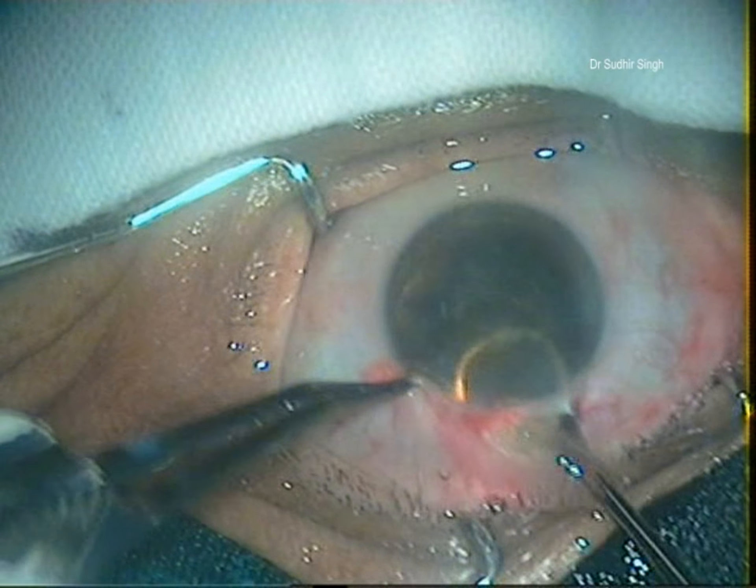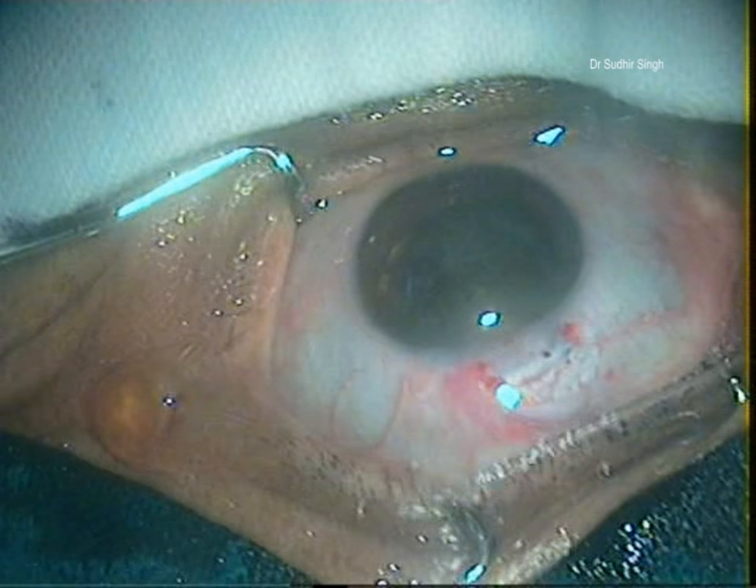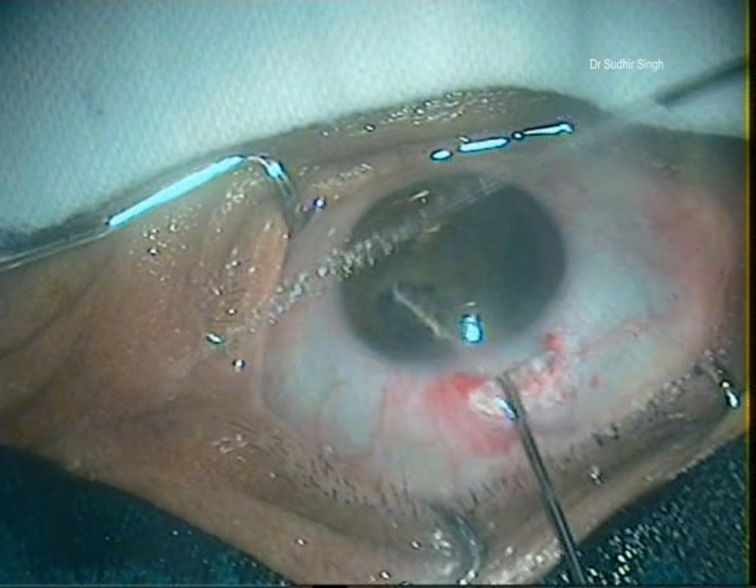Once the nucleus is engaged in the tunnel, the vectus is pulled posteriorly and upwards. This causes breaking and removal of a part of the nucleus, while the other part remains engaged in the tunnel.